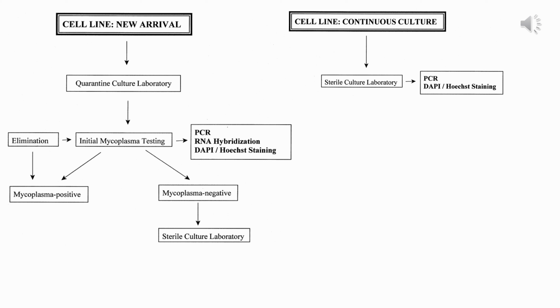There are ways to use some quinolones like ciprofloxacin and nalidixic acid and other things to get rid of these Mycoplasma, but those are also topoisomerase inhibitors. They also cause inhibition of cell growth, and toxicity to your cells also. So it's very difficult to get rid of Mycoplasma, and the easiest is to basically throw the cultures away. And if you have frozen vials also, they have to be thrown away. Okay.